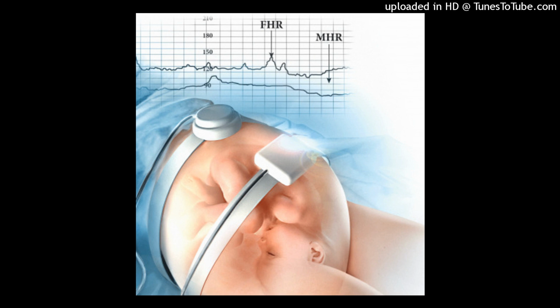Standardized definitions are used to describe UA, which is quantified as the number of contractions in a 10-minute window of time, averaged over 30 minutes. Frequency is calculated from onset of one contraction to onset of next contraction, described in minutes. Duration is calculated from onset of one contraction to end of the contraction, described in seconds. Intensity is the strength of contraction peak.